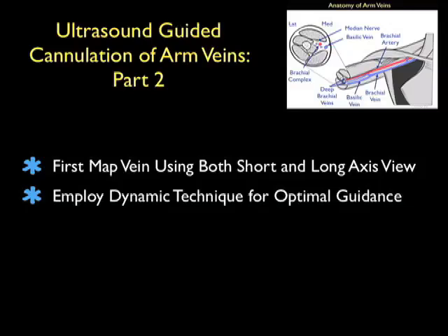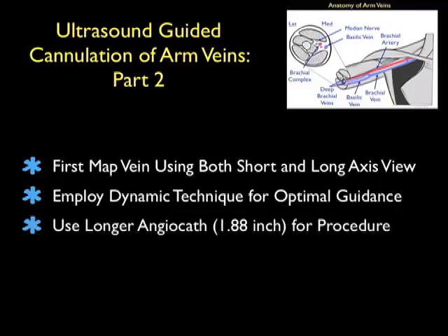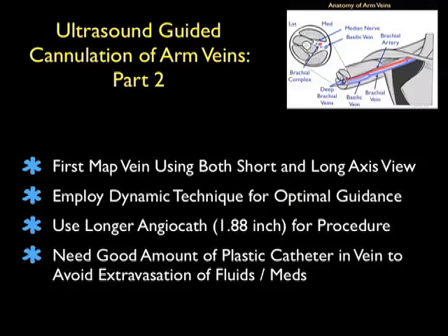As we discussed in Part 1 of this module, we first want to map out the vein using both short and long axis views, and we'll employ a dynamic technique for optimal guidance of the catheter down to the vein. We want to use a longer angiocath for the procedure, preferably 1.88 inch or longer, as we need a good amount of the plastic catheter in the vein to avoid extravasation of fluids or meds during resuscitation of the patient.